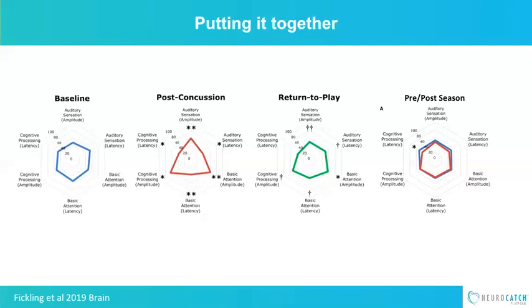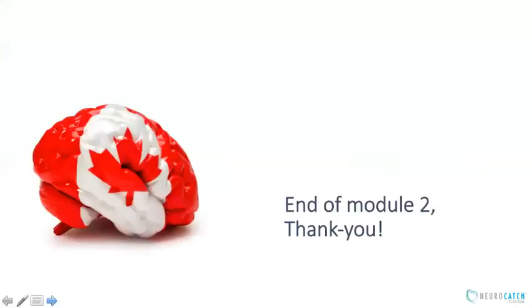So this is kind of the clinical value of NeuroCatch for what we know it to be today in our research, is that it allows you that important objective cognitive function measurement to benchmark and or to track treatment. And you can now not just know, hopefully, when you look at these waveform results, what you're looking at in terms of these 3 measures, but you can also start to map what they mean when we show them to you on this radar plot.